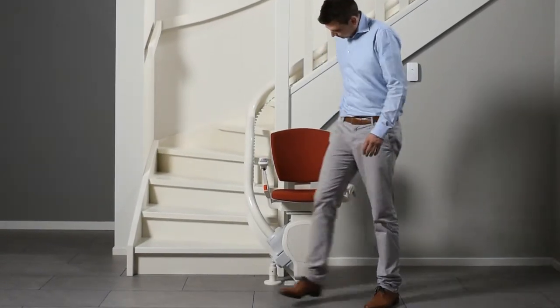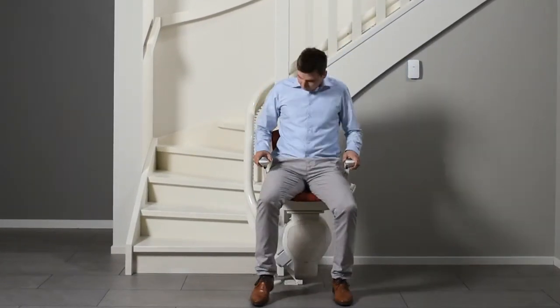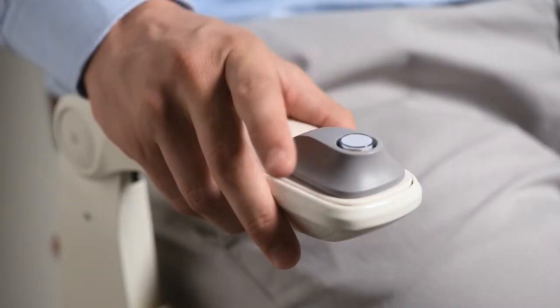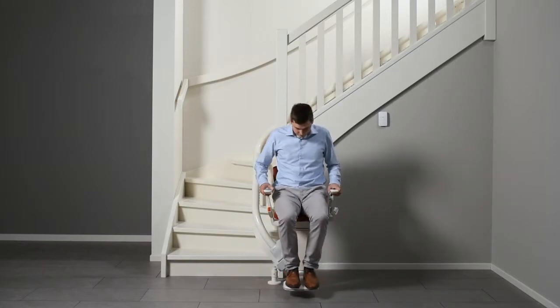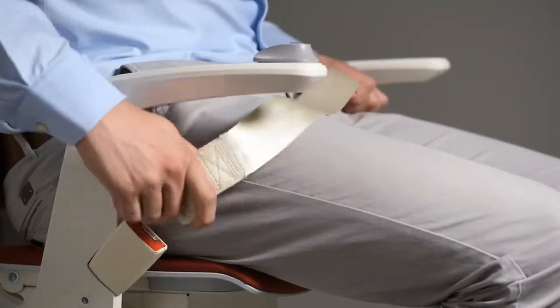Fold down the seat. Press the button in the arm to unfold the footrest — no need to bend over. Fasten the seat belt.